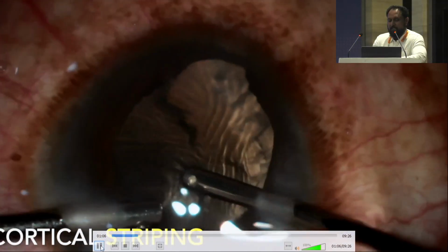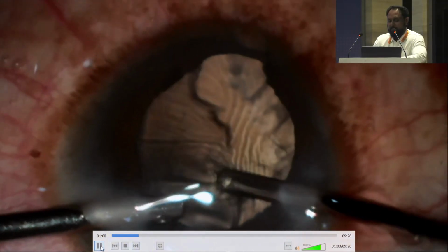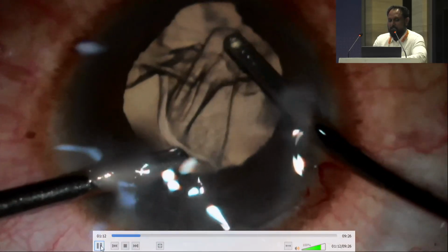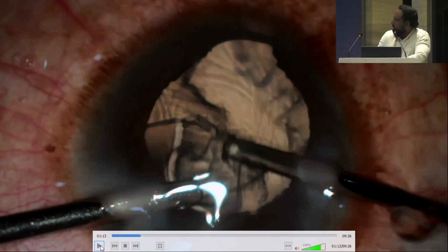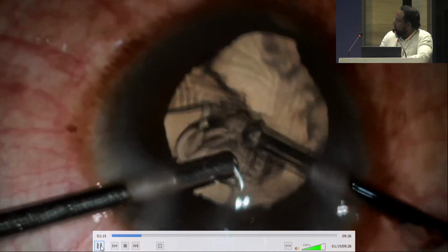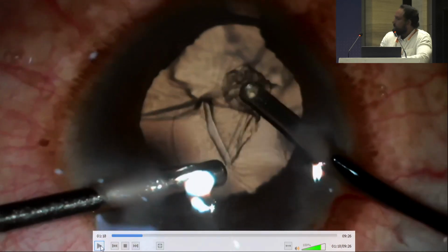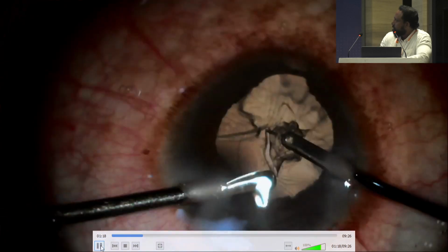And then cortical aspiration also, just minor changes, something I call cortical stripping rather than aspiration. As you can see, just holding the anterior capsular fibers there, just strip it to the center. You don't have to be in a hurry in these cases because the adjacent zonules can break. So that is where you should be careful. You should not extend the zonular dialysis.